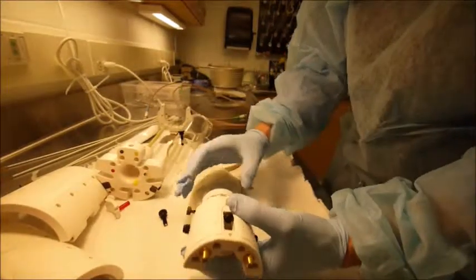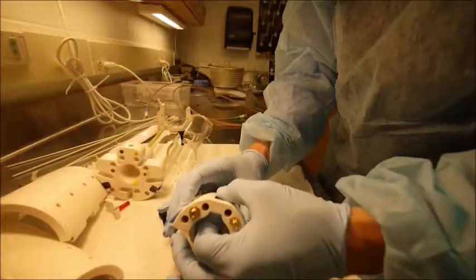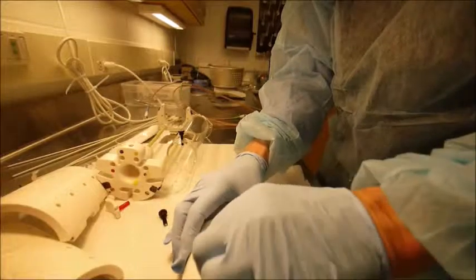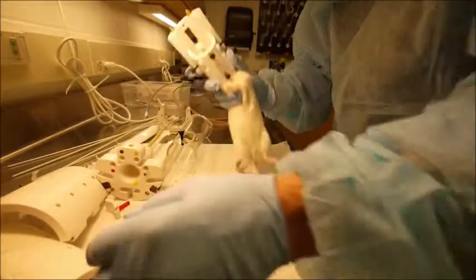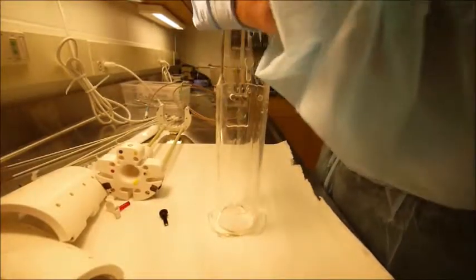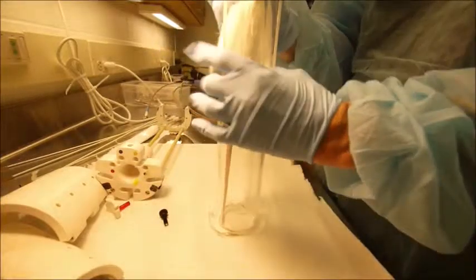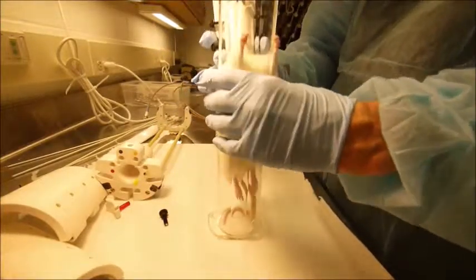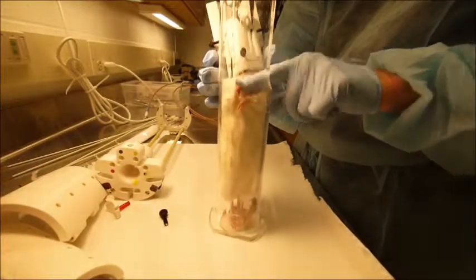Lidocaine can be placed on the bridge of the nose to minimize any discomfort at this pressure point. Drop the animal into the body tube, tucking the forearms underneath. You may choose to tape the forepaws to discourage any effort to escape; if so, remember to do this during acclimation.